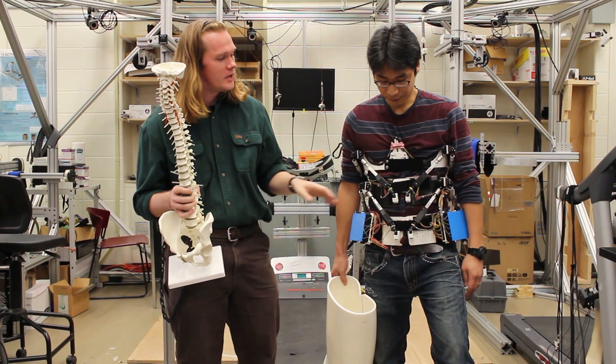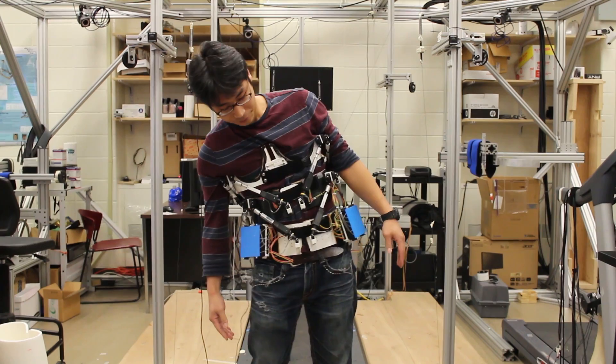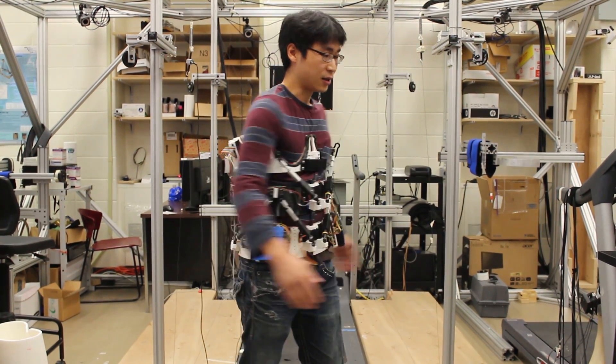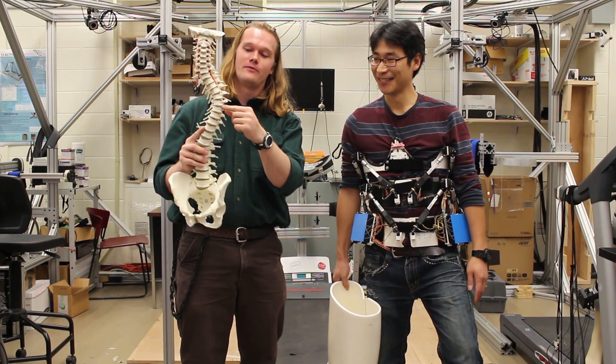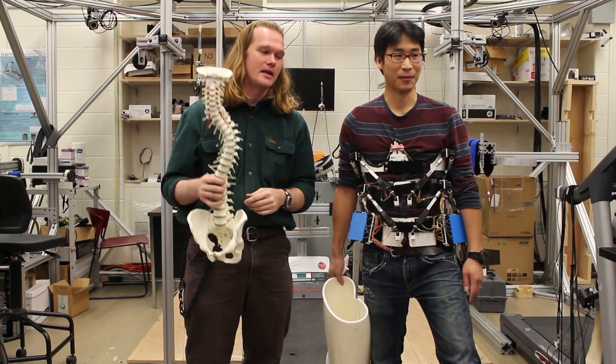The way it does that is by having three separate rings that push at the top and bottom of the curve, and then apply a force to the apex of the curve, essentially pushing everything back into alignment.